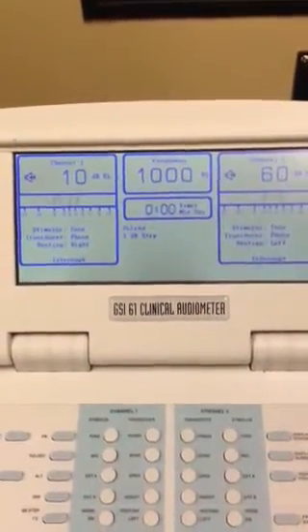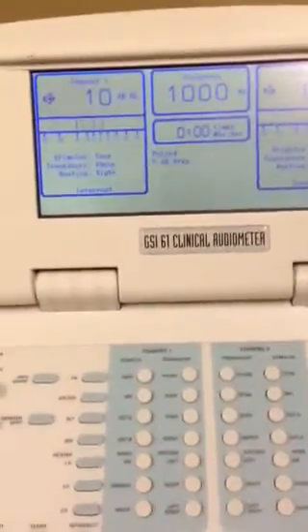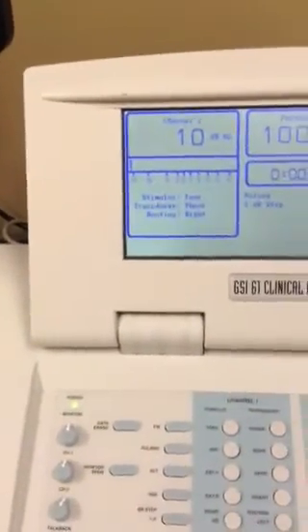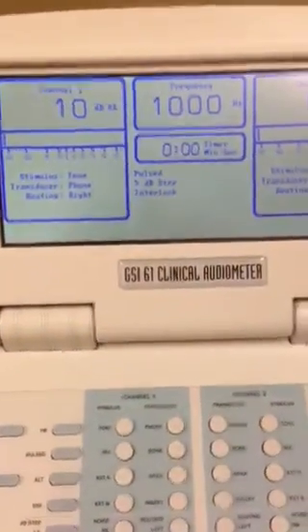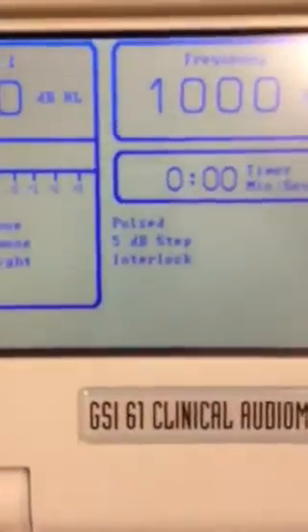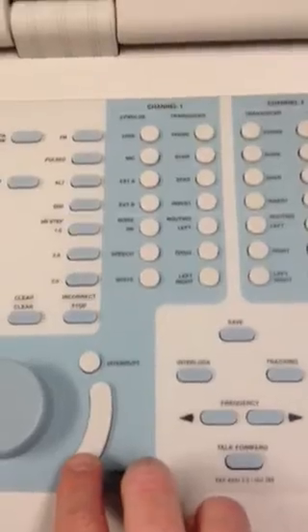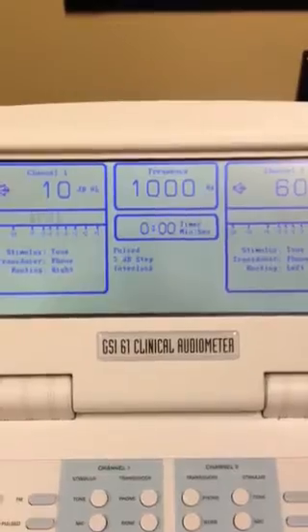If you were actually doing this test with a patient or somebody else, instead of using the interrupt button you can use the interlock button here. You press the interlock button and then you see the interlock selected there. Then just use the regular present button, and as you do that, both channels come on interlocked.